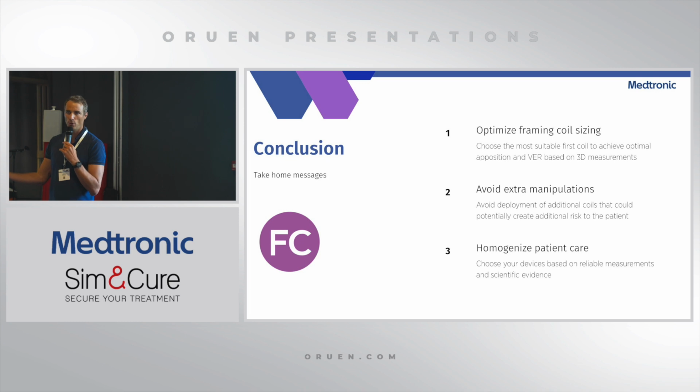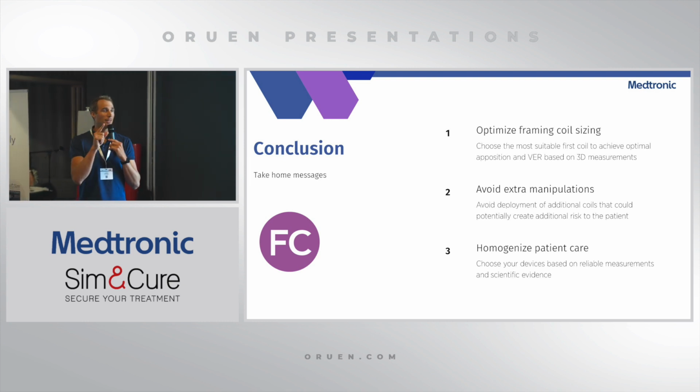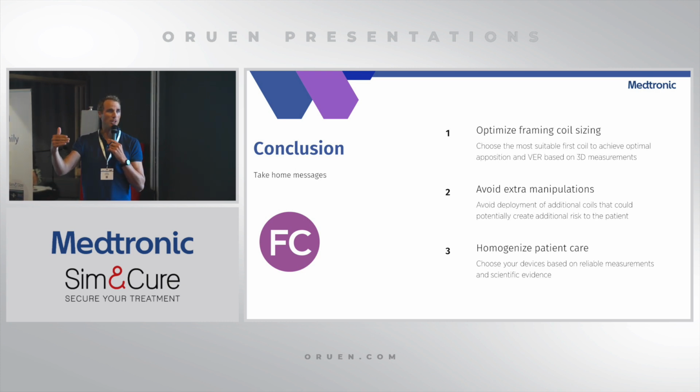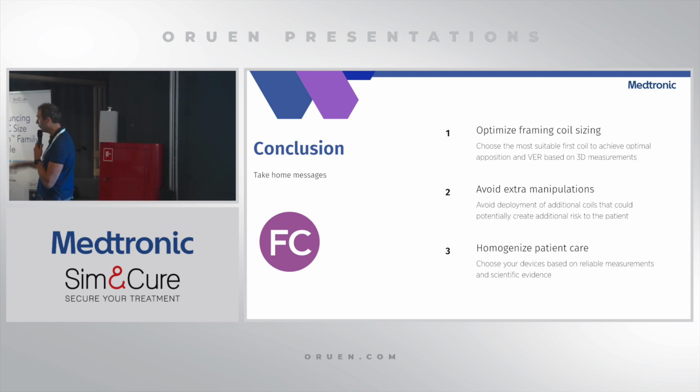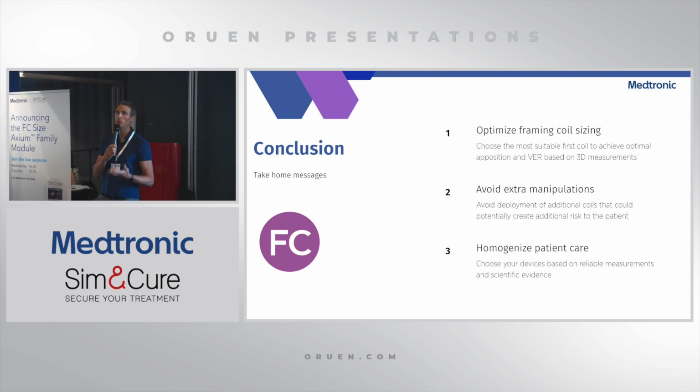You optimize the first coil and you control the progressive filling of the aneurysm in order to reach the target volume embolization ratio. You have to decide. Could be 10% if you add a flow diverter just to have some healing. Would be 25% because it's simple coiling. Because you have a stent, we stop after 15%, but you act differently in your head in order to get a homogenization of the patient care. Because in the team, everybody's doing differently, but when you get this tool, then you start to do a little bit in the same way, and homogenization is also the definition of quality.